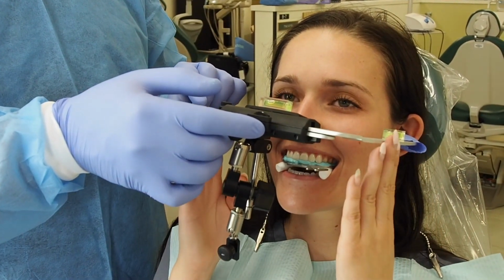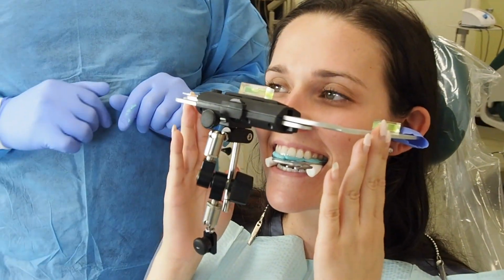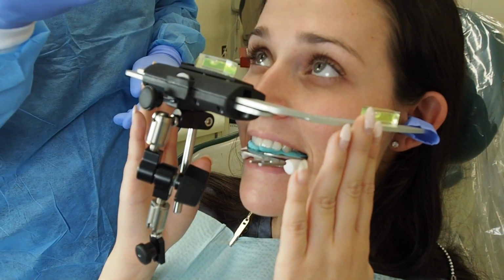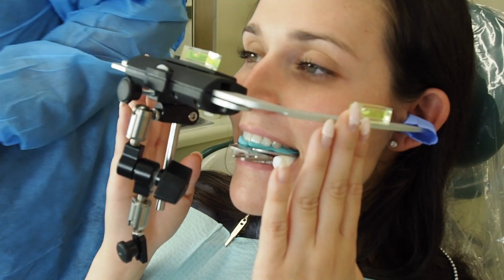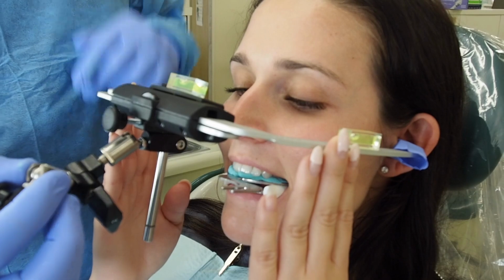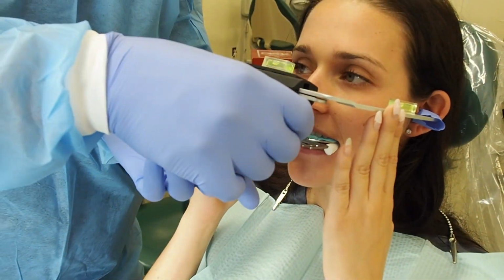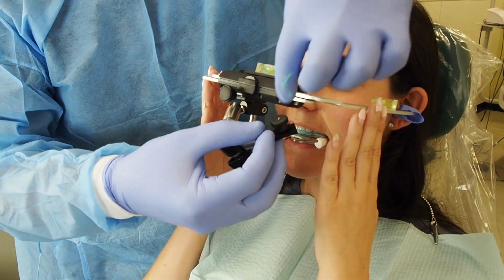No, you always take it, okay? And I'm going to just put it right where the third point of reference was made, based on, remember? Based on the Denar third point of reference finder, okay? Once I have that, then I will connect the articulated arm onto the fork, like this. If you see it, it's got number 1.